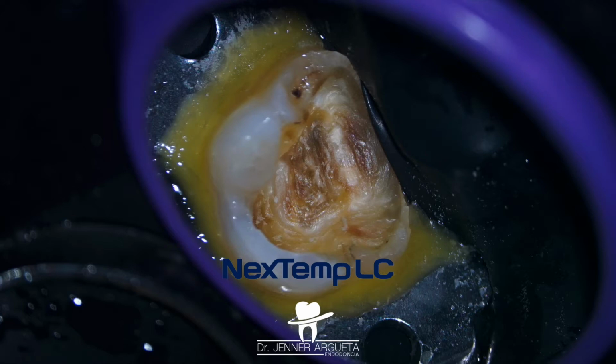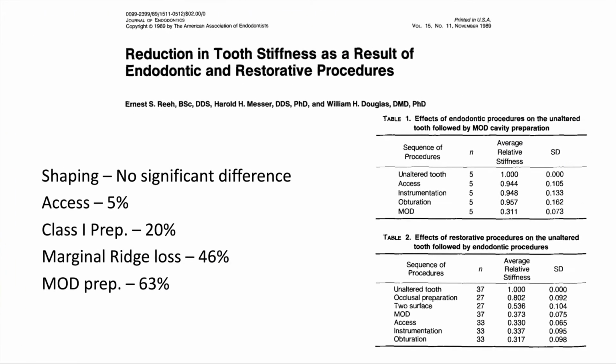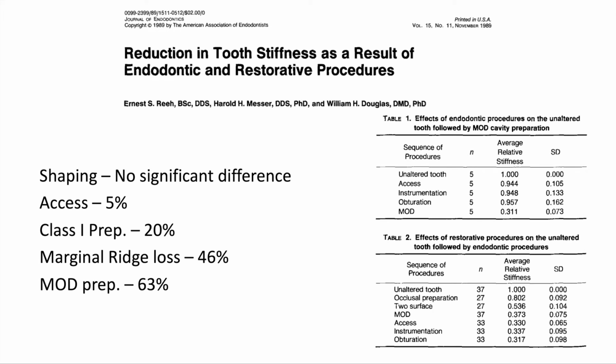With the ultrasonic tip, we can be more conservative and we can take care of that healthy structure that we want to maintain.